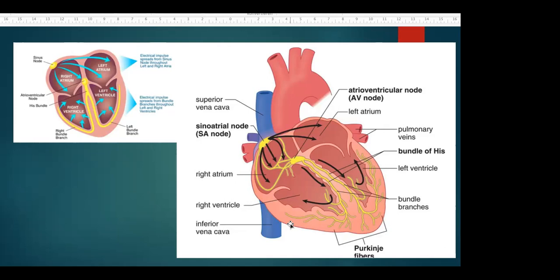Many people don't know that you don't need the surgical pacemaker immediately, but you can have a bridge until you bring the patient to the ICU. You have a defibrillator, and if you have this in your ERs, you can put the two pads on the chest of the patient and turn it into a pacemaker by setting the heartbeat at 60 beats per minute.